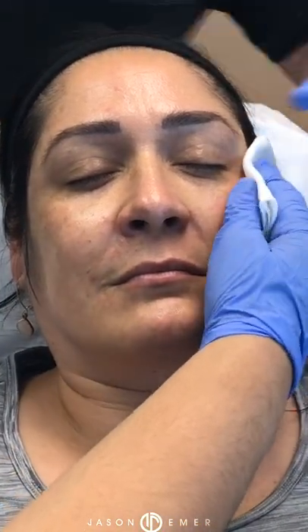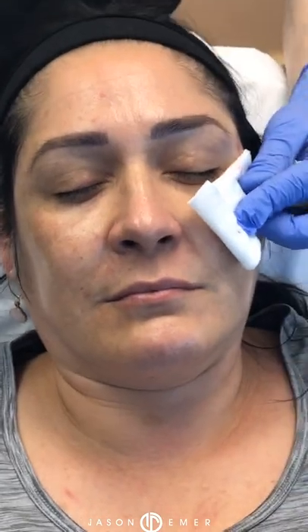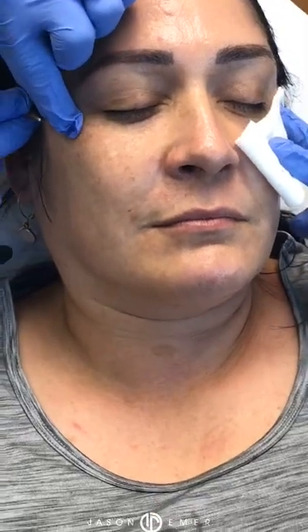And this is Restylane Define. Now this product has a little more substance, but take a look now. Look at the one side, lifted, and the other side, not. You can see it especially from overhead. So I'm going to have you switch sides with me. You can hold over here. Turn your head a little to the left. Perfect. Hold there. And we're going to accomplish that same task here.